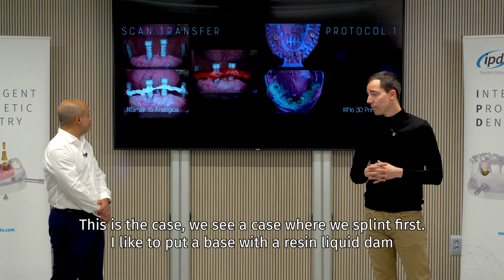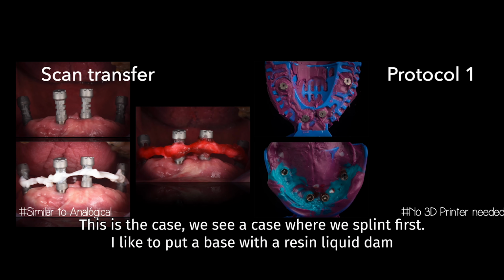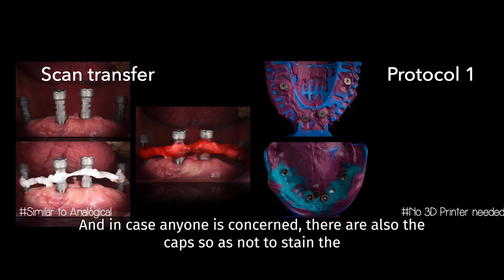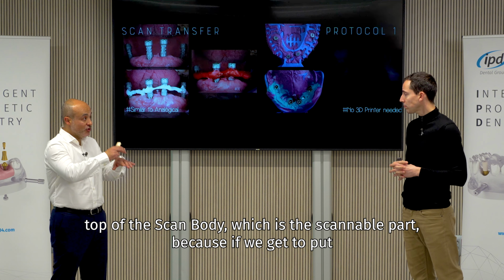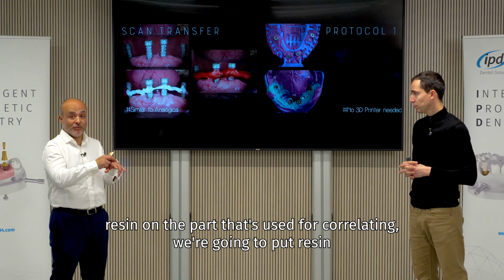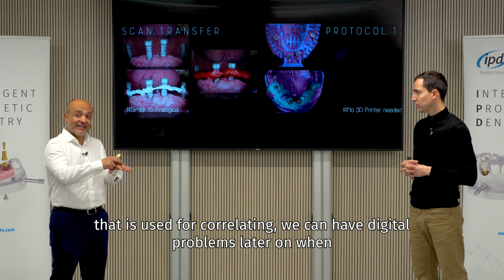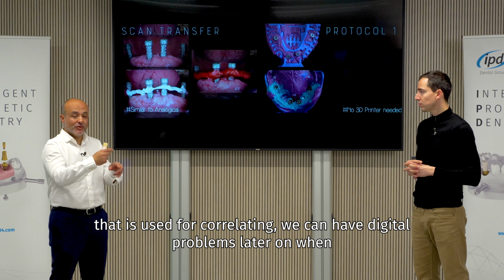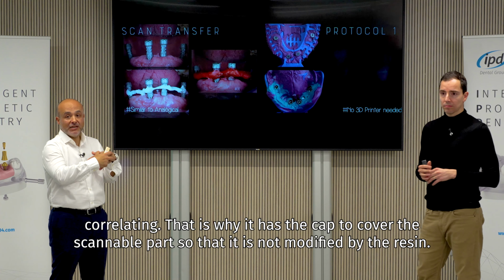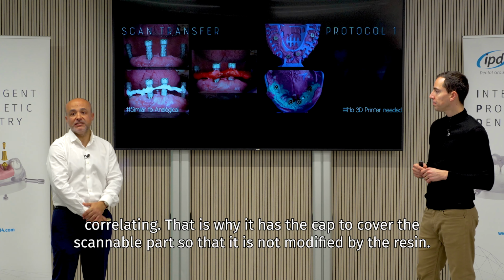This is the case. We see a case where we splint first. I like to put a base with a resin liquid dam to bond, where you could put dental floss, but this is faster. And in case anyone is concerned, there are also the caps, so as not to stain the top of the scan body, which is the scannable part. Because if we put resin on the part that is used for correlating, we can have digital problems later on when correlating. That is why it has the cap to cover the scannable part, so that it is not modified by the resin.